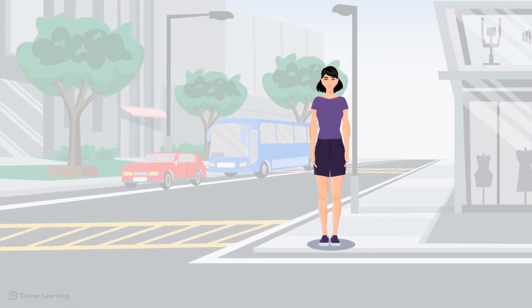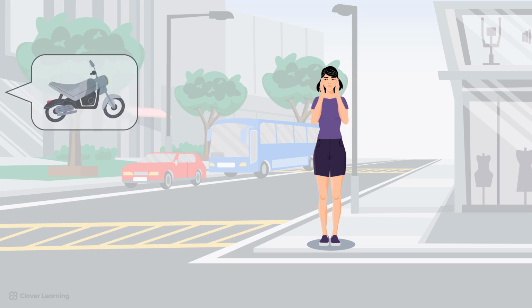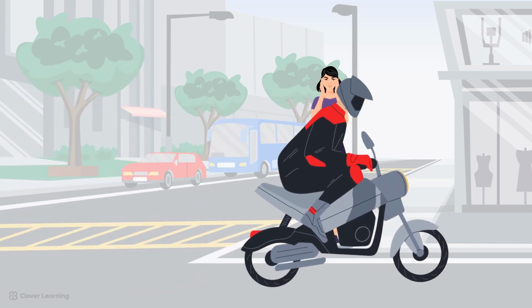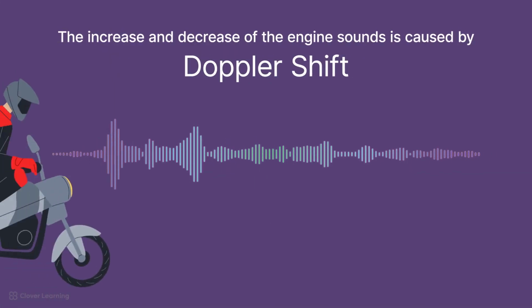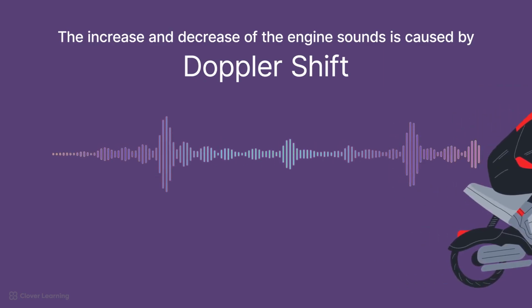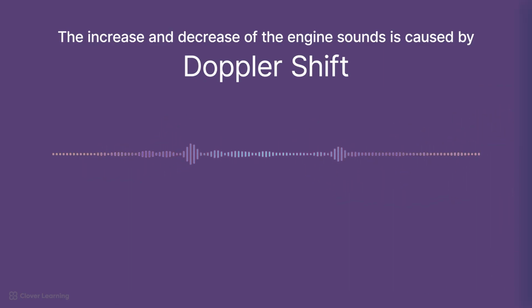Think about when you're standing at a street corner and you hear a motorcycle approaching. As the motorcycle approaches, the engine sounds increase. As the motorcycle drives away, the engine sounds decrease. The increase and decrease of the engine sounds is caused by the Doppler shift.